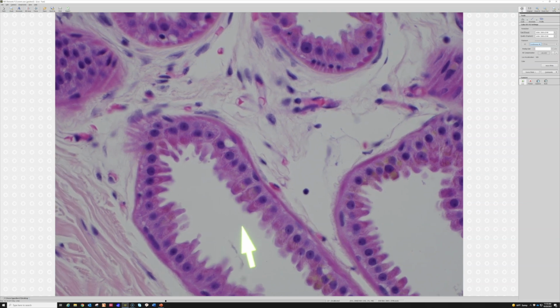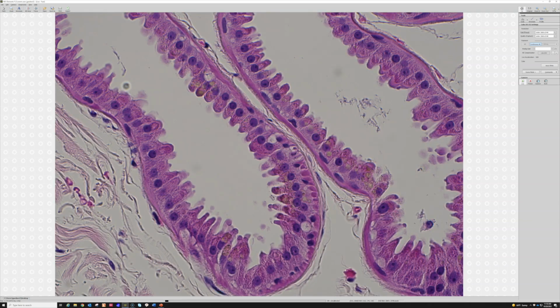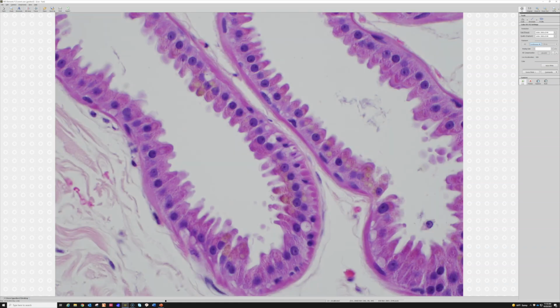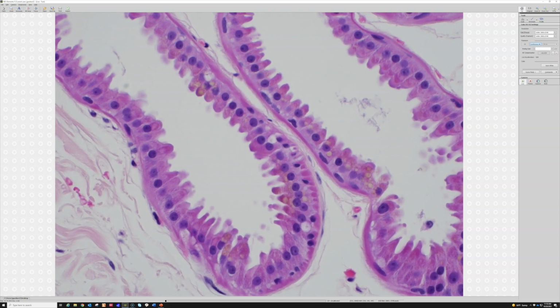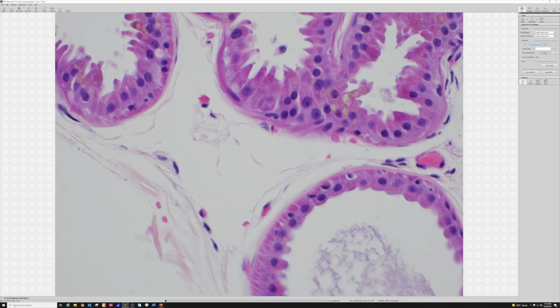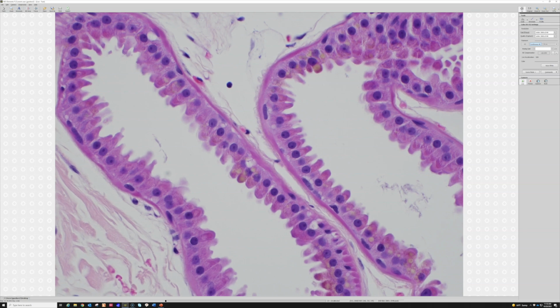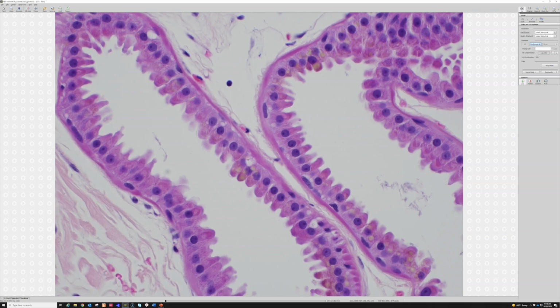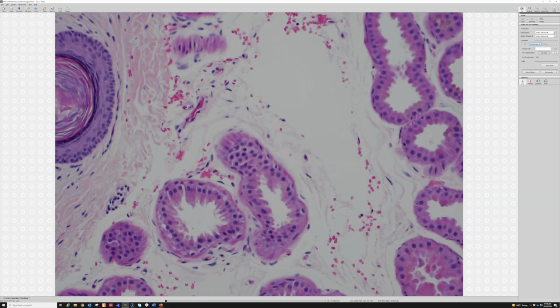And the nuclei are much bigger than those of eccrine glands. They're large and they're very perfectly round. They tend to have prominent central nucleoli. They look like little eyeballs staring at you. They look like the one-eyed minion from the Minions movie. I can't remember his name. But in any case, that's what they look like. Someone told me that on Instagram a few years back, and I thought that was so cool and accurate. So anyway, all those are the features of apocrine glands.